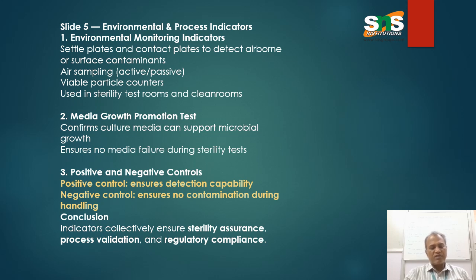So, conclusion about the indicators. Indicators collectively ensure sterility assurance levels. Thereby, it gives an indirect report that a particular process is effectively undergoing sterilization, and it puts the product in the completely microbe-free category.